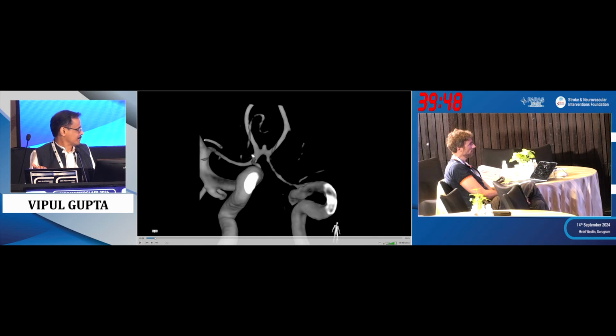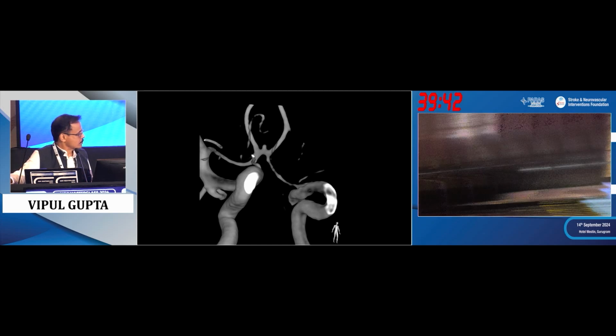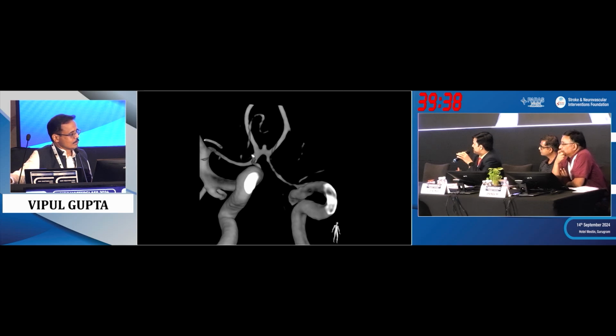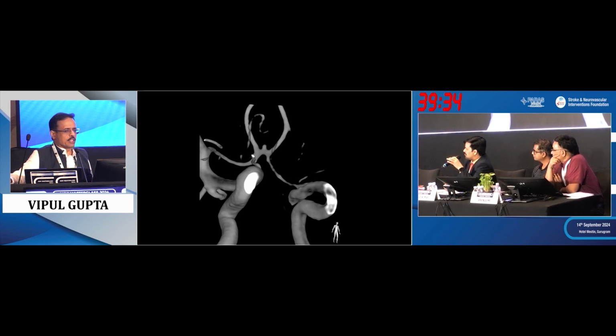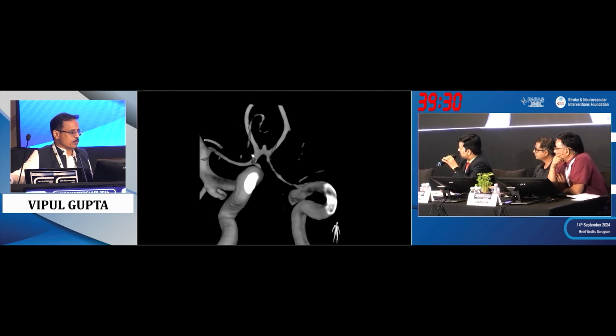It's all right. Okay. But Vipul sir, if the aneurysm were even smaller, which we encounter many a times, and the anatomy is like this, then how to go about? Because this is a very difficult situation. Then I would just, if it is even smaller, I will just deploy the stent and let it be. Maybe a stent or a flow diverter?